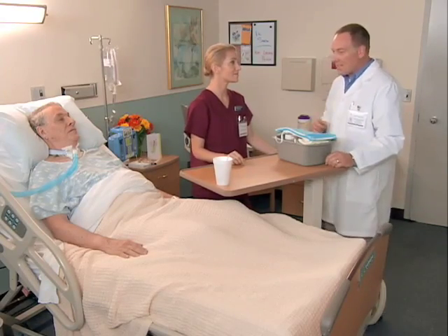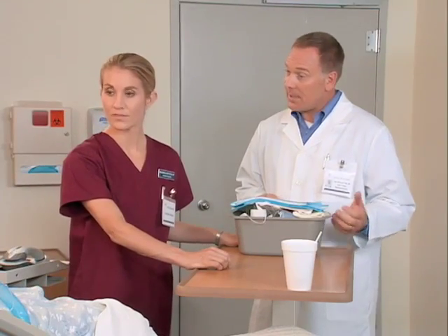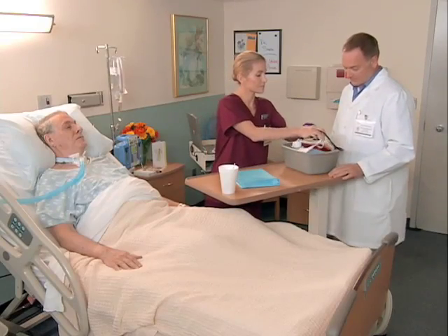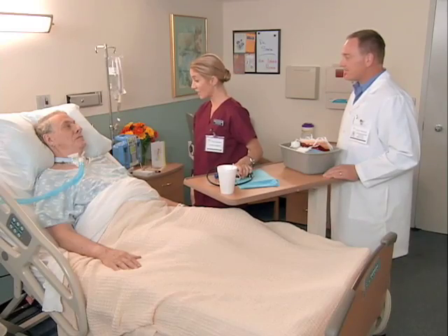I'd place the patient in the lateral position facing me instead of in semi-Fowler's position. Okay, good. Now, assess Mr. Marks's respiratory status, including his respiratory rate, oxygen saturation, and lung sounds. Okay, Mr. Marks, I'm going to listen to your chest, okay?